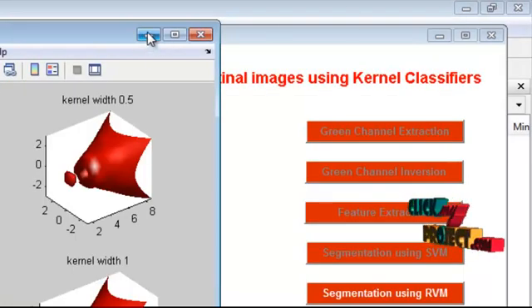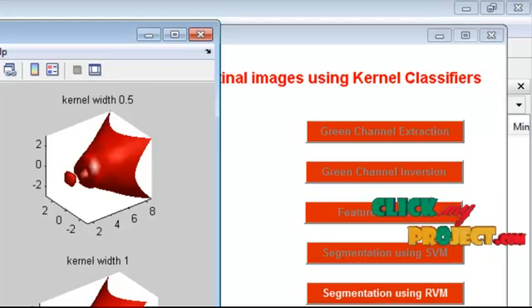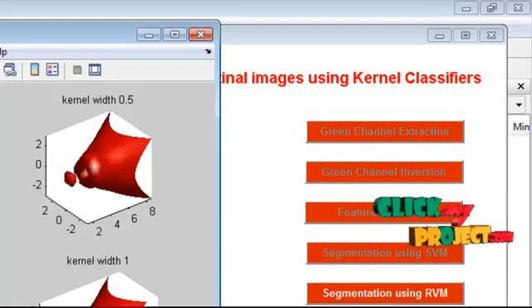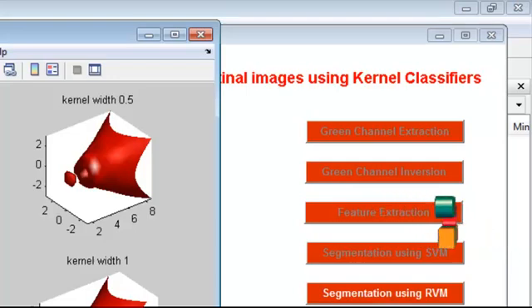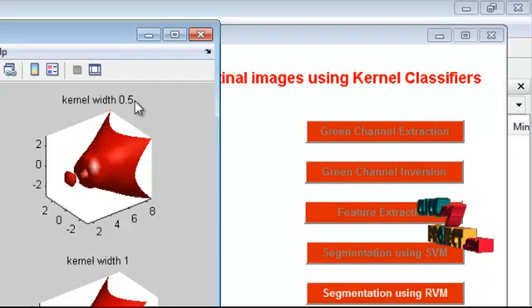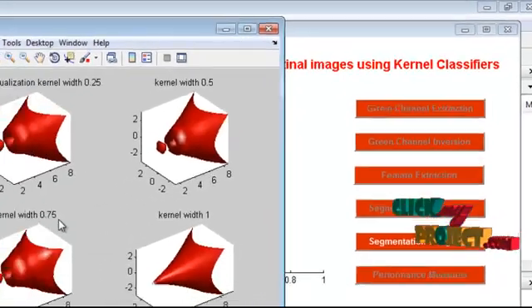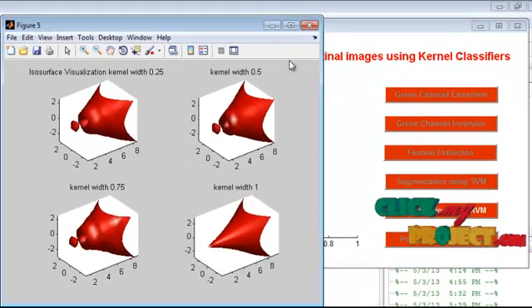This is the SVM segmentation result for the chosen kernel values, and this is the isosurface visualization of kernel widths 0.25, 0.5, 0.75, and 1.